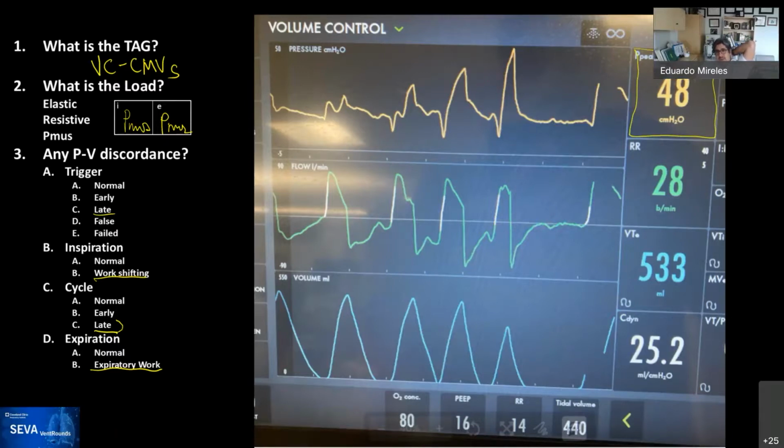Whenever you hit the peak pressure in this ventilator, you get this little reminder of where the alarm is. Actually, you can see the alarm is set at 5 and 40 for the respiratory rate and the peak pressure at 50. So it got cycled off early because it hit the peak pressure, and the I time was shortened because of that. Perfect. That's what shortened it.